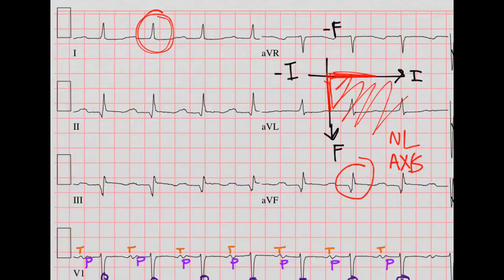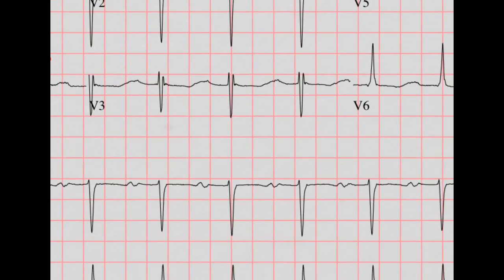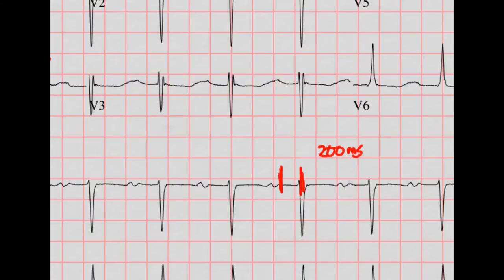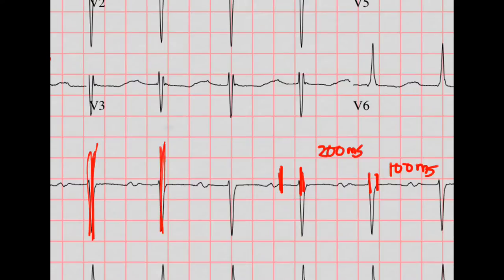Now we're going to do the intervals. We'll look at these leads here. First the PR — that's about one box, so I'm going to say that's 200 milliseconds, which is normal. Then we'll look at the QRS. There are no small boxes on this picture, but it looks like it's about two to two and a half small boxes, so I'd say about 100 milliseconds — that is normal. And then finally, let's look at the QT. Drawing a big line through the start and end, with a dotted line down the middle, you can see that the T wave is to the right of this line. So the QTc is prolonged.